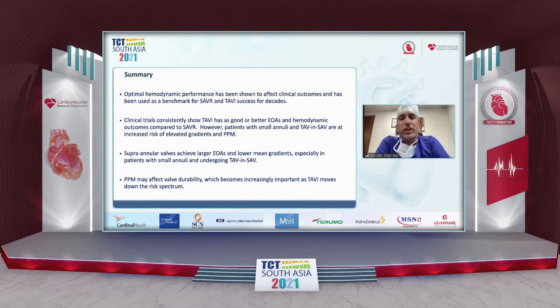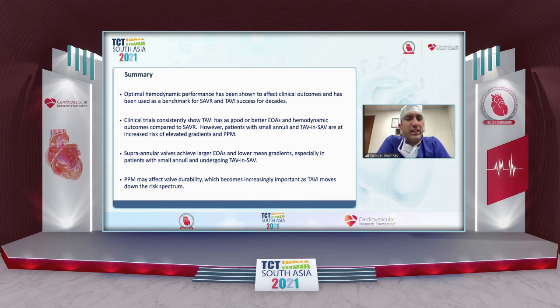Summary: optimal hemodynamic performance has been shown to affect the clinical outcomes and has been used as a benchmark for surgery and TAVI success for decades. Clinical trials consistently show that TAVI with a supraannular valve has better effective orifice area and better hemodynamics, and they achieve larger EOAs. Patient prosthesis mismatch may affect the valve durability, and we need to wait for the long-term data.